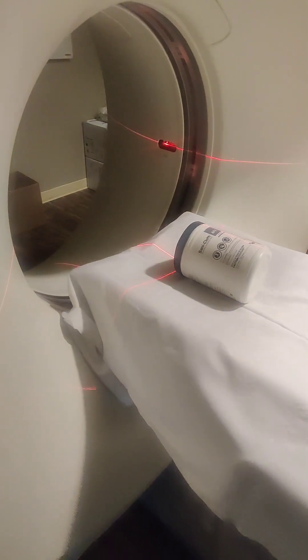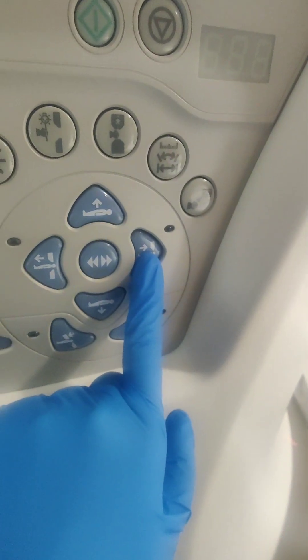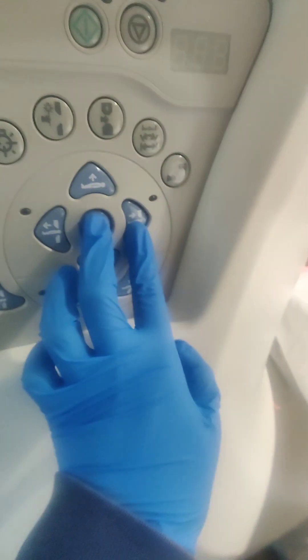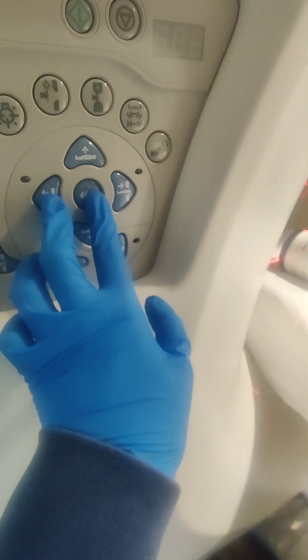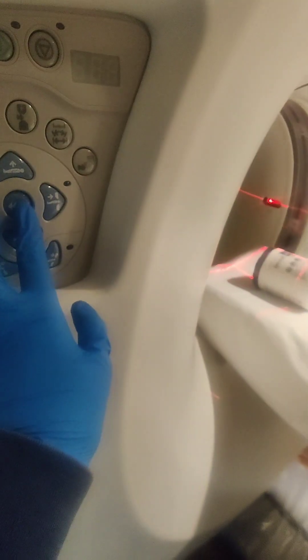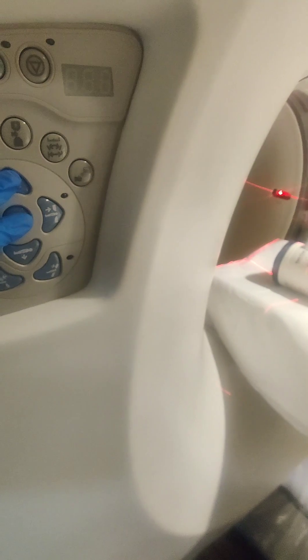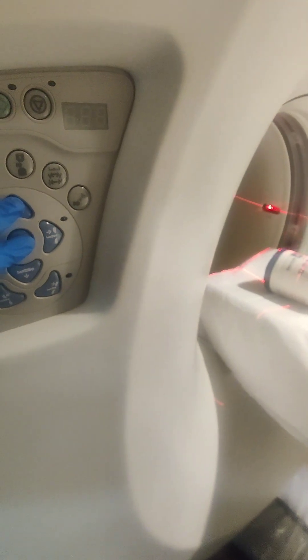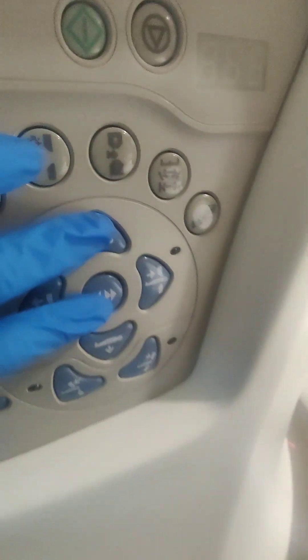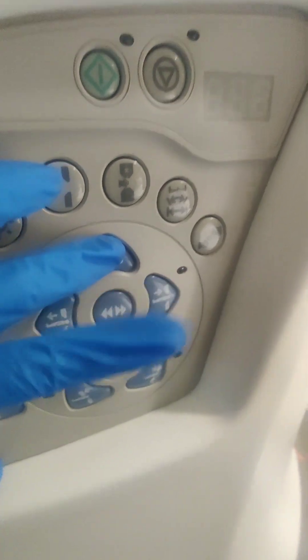So what we want to do is move the patient in. If you just press one button, it's going to go very slow. If you press the button in the middle at the same time, it moves really fast, vice versa, going in or out, or even up or down. With the middle button, it goes up fast. With just the single button, it goes really slow.